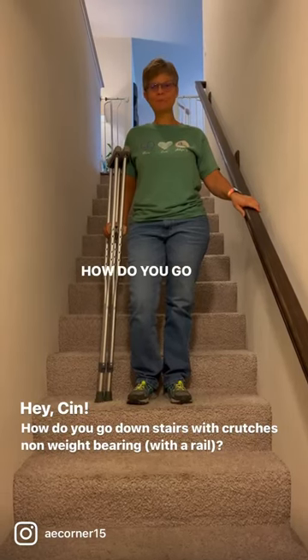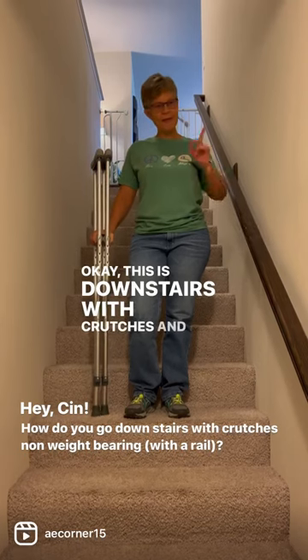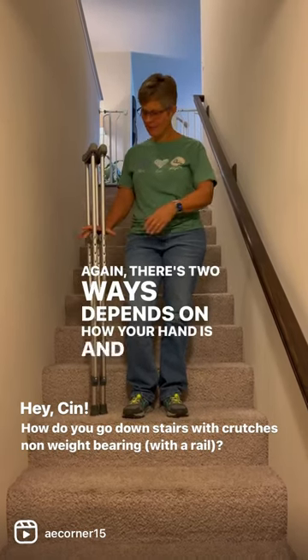Hey, Cyn. Hey, what? How do you go downstairs with crutches? Okay, this is downstairs with crutches and a rail. There's two ways. Depends on how your hand is and your thumb position.